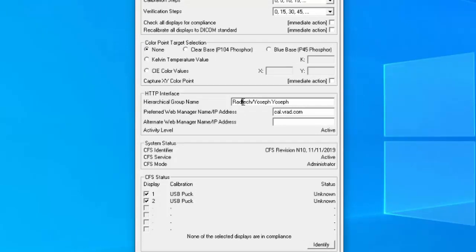If they are PDM, meaning they have a primary diagnostic monitor that New York City used to require, that can self-calibrate, they are in the PDM group. If they are standard, which means they have HP monitors but they calibrate with a puck. In my case, I'm just a rad tech, but I'm also considered standard because I don't have PDM monitors.